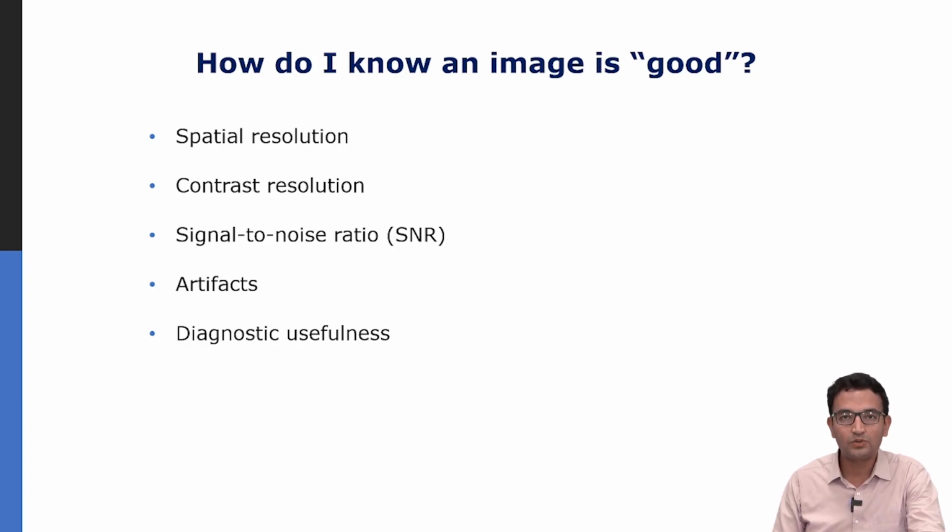What is spatial resolution? I believe you're already quite familiar with the concept of spatial resolution, or at least the resolution of an image. When you capture an image using your camera, if you get a sharp image, that image has good resolution. If the image is in focus, then you get good resolution. However, if let's say you move the camera while taking the image, it gets blurry and the resolution gets degraded. So that is what spatial resolution is all about.